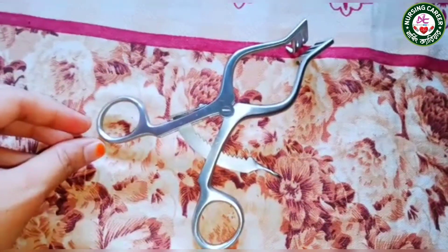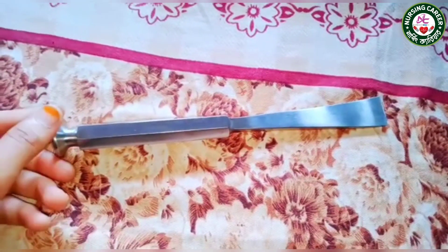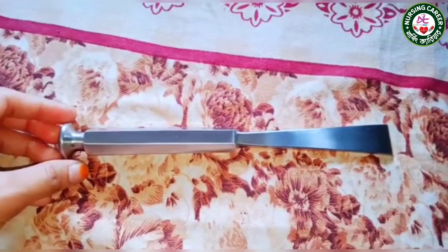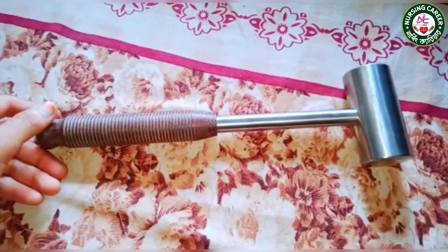This is an osteotome. It is used for cutting or preparing bones. This is a hammer. It is used with the osteotome.